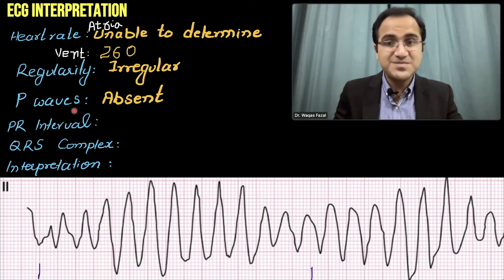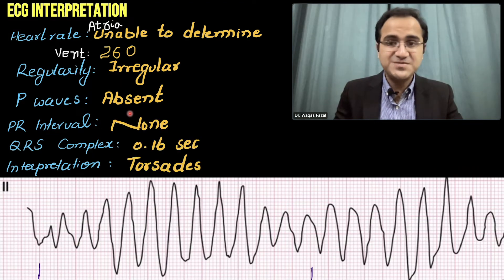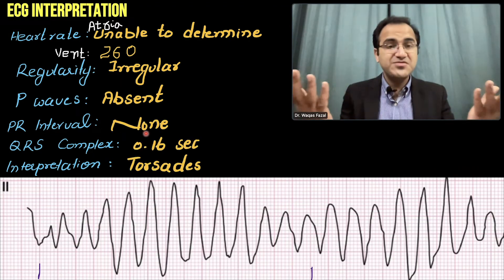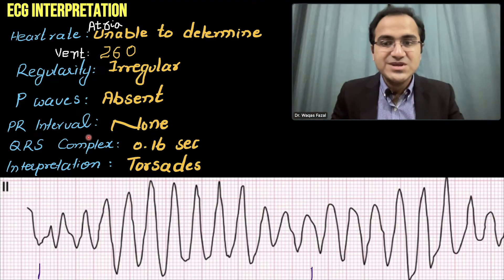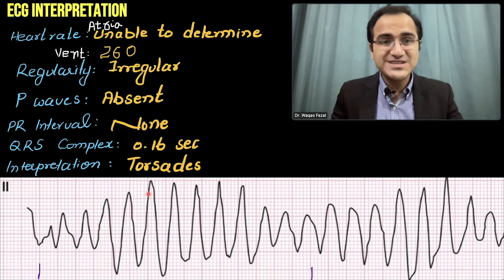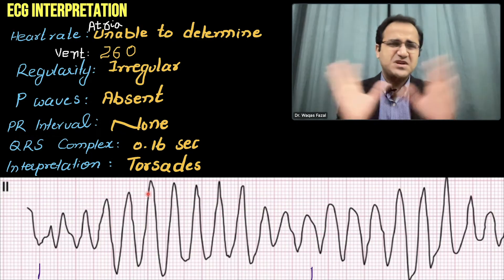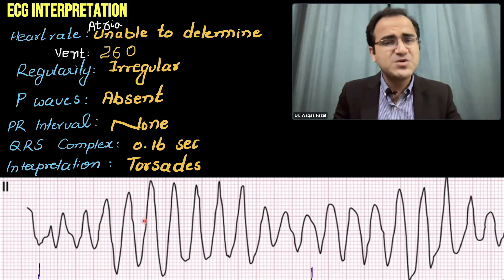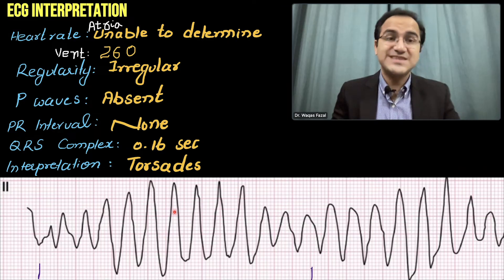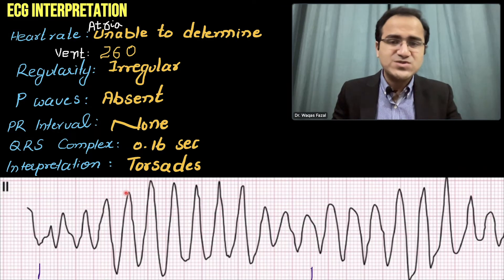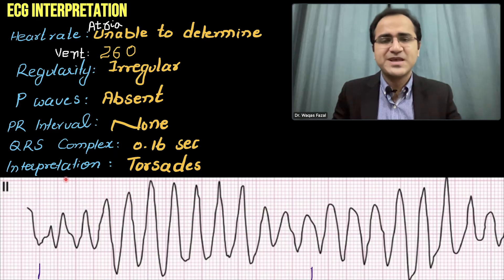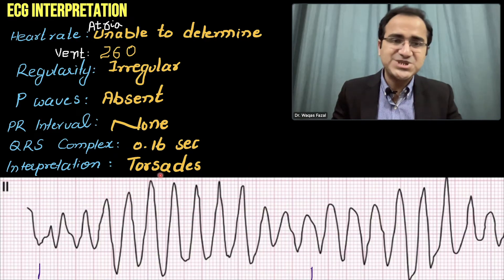Regularity is irregular. P waves are absent, so there is no PR interval to measure. Determining the exact size of the QRS complex in torsades is very difficult because we cannot identify exactly where the QRS complex starts and ends. We can simply state that the QRS complex is wide. The interpretation of this ECG is torsades de pointes.